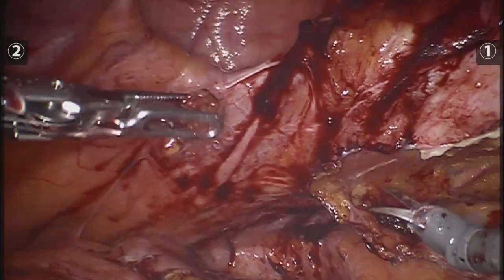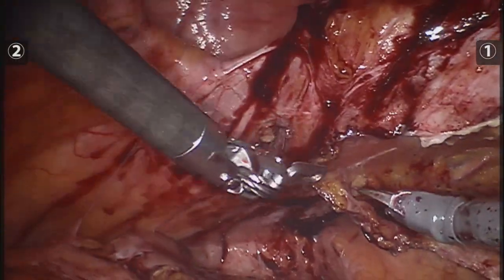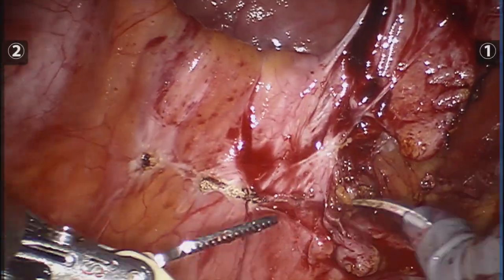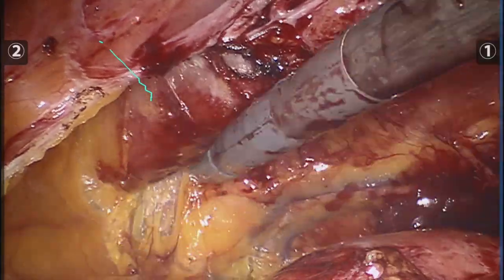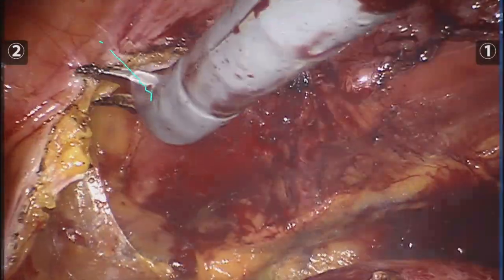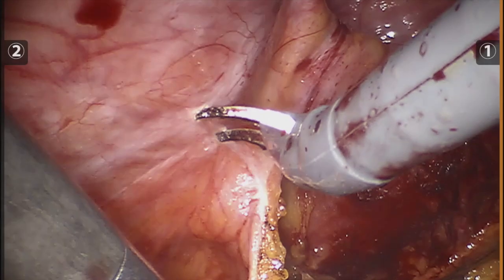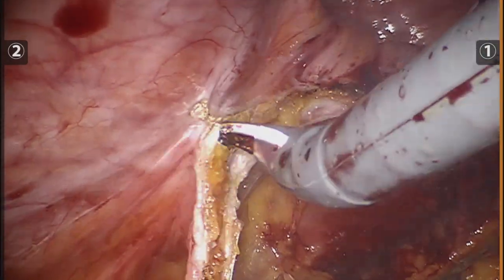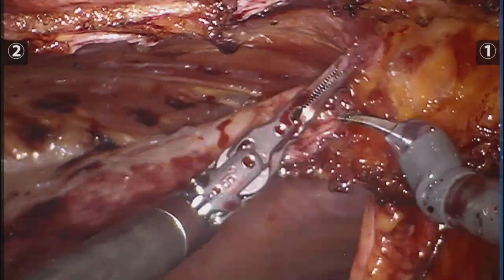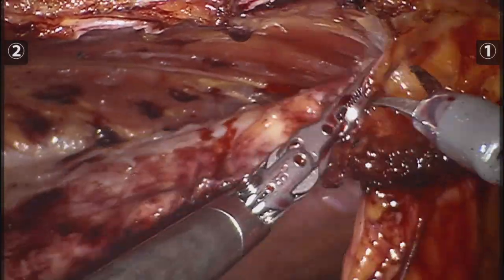Here we're finally getting to the bottom of the second defect. My assistant is pointing out where the suprapubic region is, and we're getting access to the rectus space and finally doing the crossover to the right retrorectus space, which I stop right there, and go back to the subcyphoid on the left side.